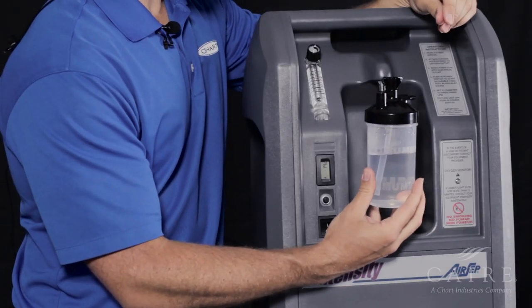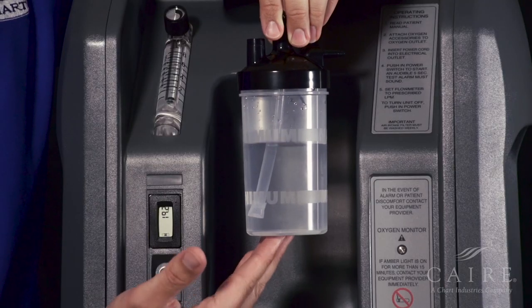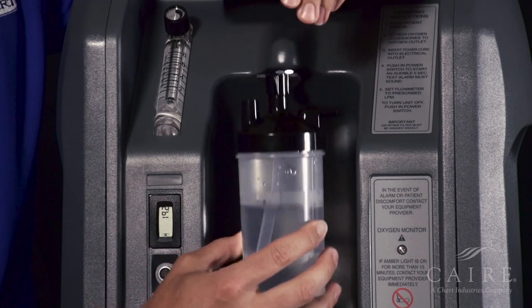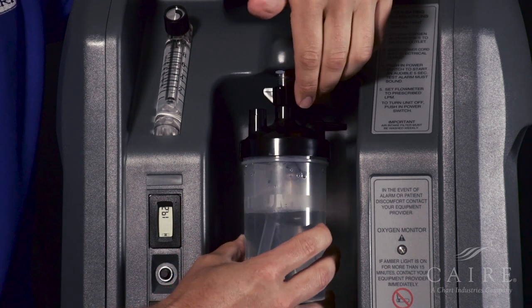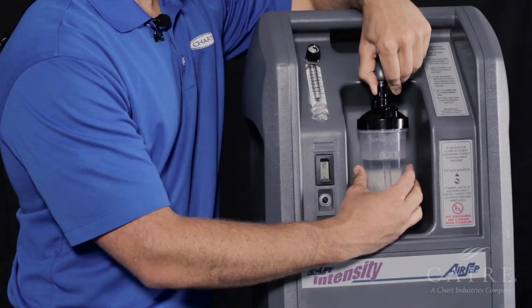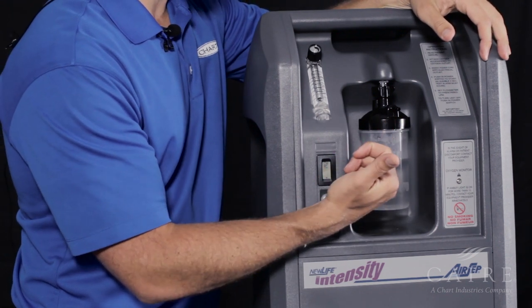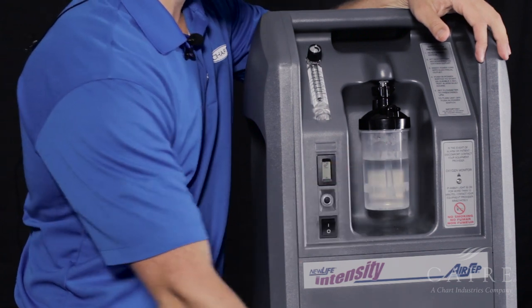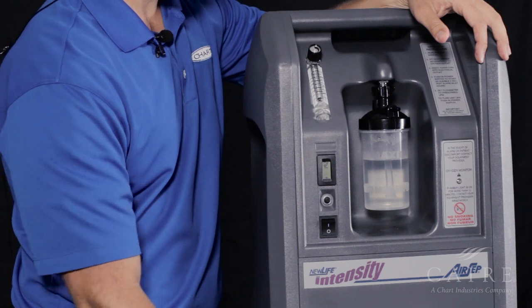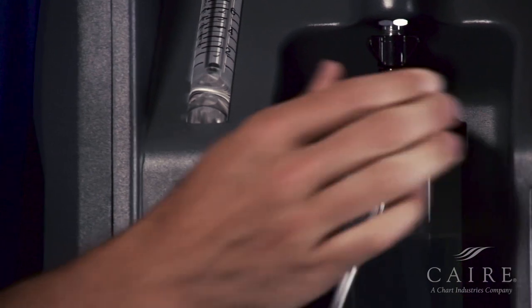Now we're going to attach the humidifier bottle. Make sure you fill the bottle with distilled water between the min and max — not to overfill. Once filled properly, simply take the top, line up the threads, and screw it on, like so. Once tight, make sure that your outlet side is facing towards you or the front of the unit. Now we can connect the cannula — simply take the female end and connect to the male end, like so.